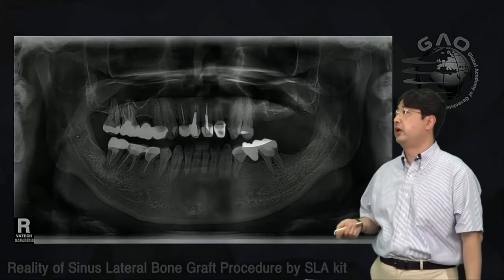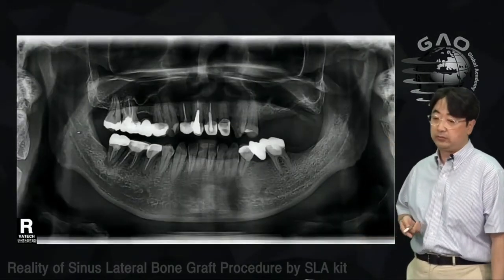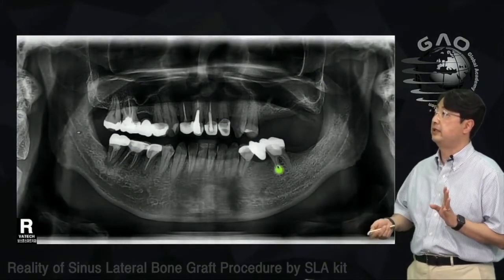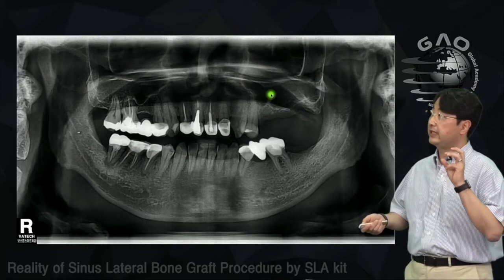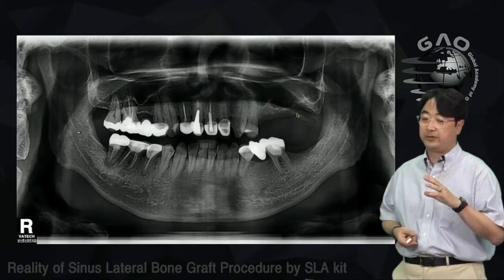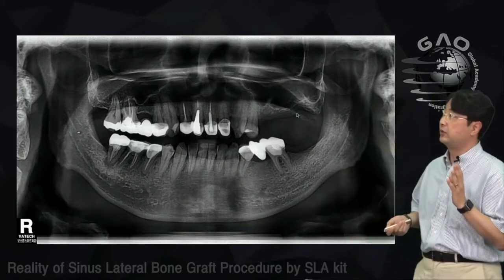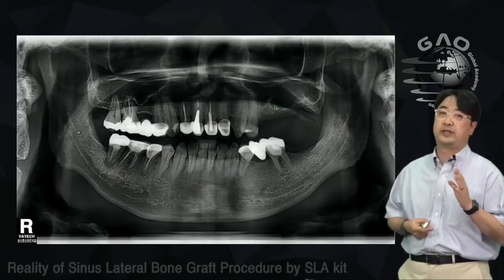After removing teeth 25 and 27, I need to place implants, but there is a septa here dividing the sinus into two different compartments. One part has a little bone and the other has less bone at the crestal area. I decided to do the crestal approach for the anterior implant and the lateral approach for the posterior implant.